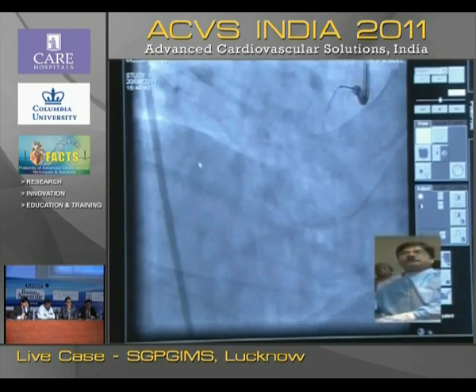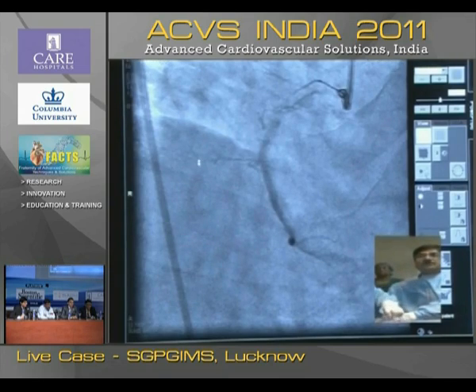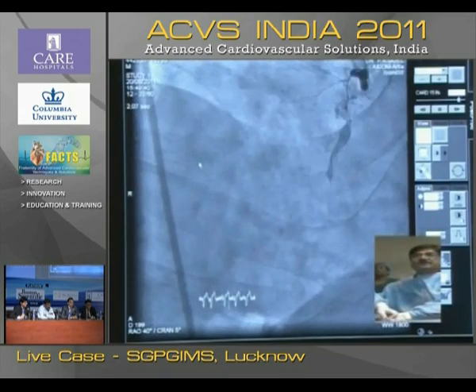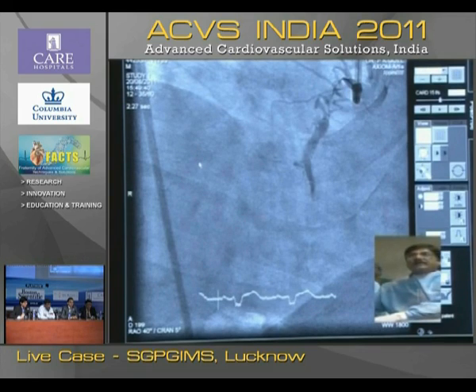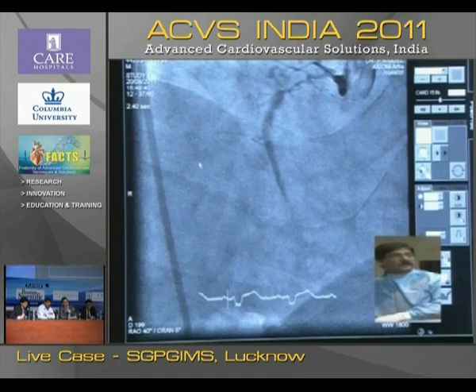Inject please. Yeah, it looks okay. Can you stop it? Freeze. Well, looks okay. It's heading in both the directions there.